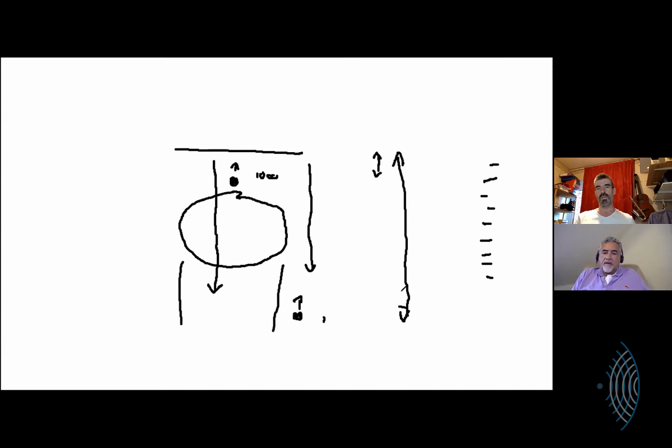And so what you want to be able to do, if you want to look at this in detail and not have it whited out in front of you, is change the sliders here to make a difference. On our Instamatic devices that I carry around, that don't have the ability to change apertures or whatever, I guess they have a surface, a middle, and a deep gain. And so all that would be is turning the contrast down, or, just turning the gain down. The contrast is something slightly different, but yeah, it's turning the gain down at the back of the picture.